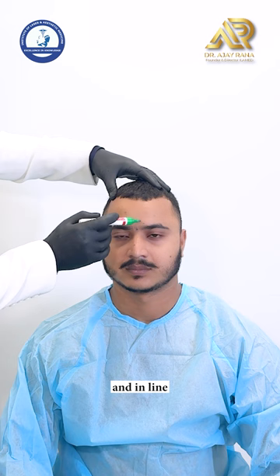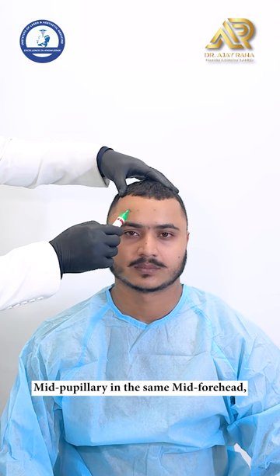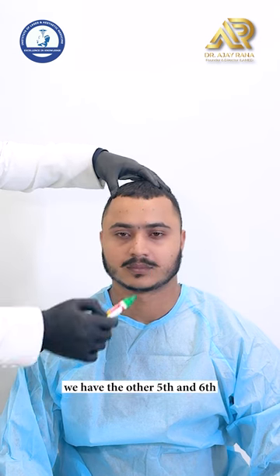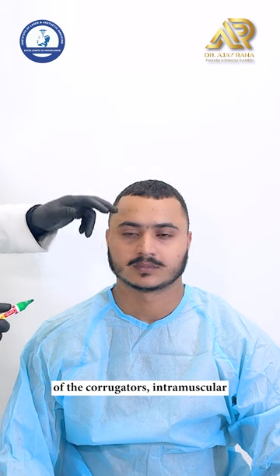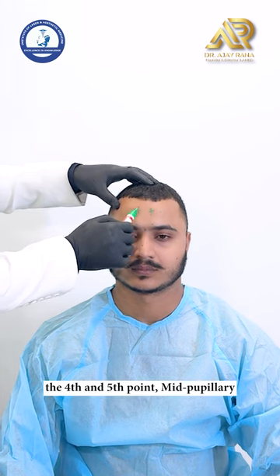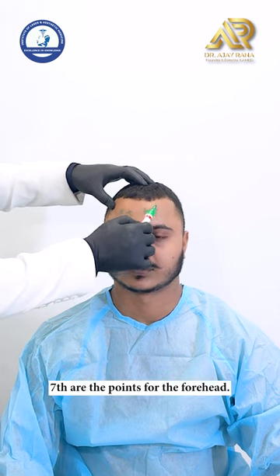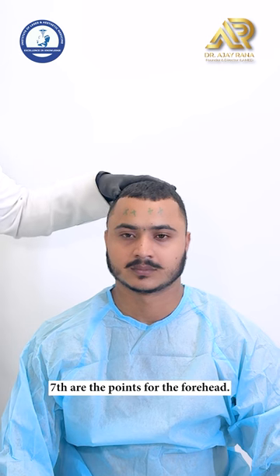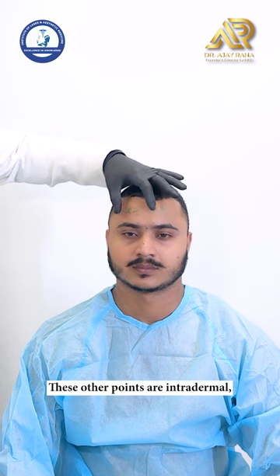In line with the corrugator point at mid forehead is the fourth point, and in line with the other corrugator at mid forehead is the fifth point. At mid-pupillary line on the same mid-forehead level are the sixth and seventh points. So procerus and both corrugator bellies are intramuscular; the remaining forehead points are intradermal.